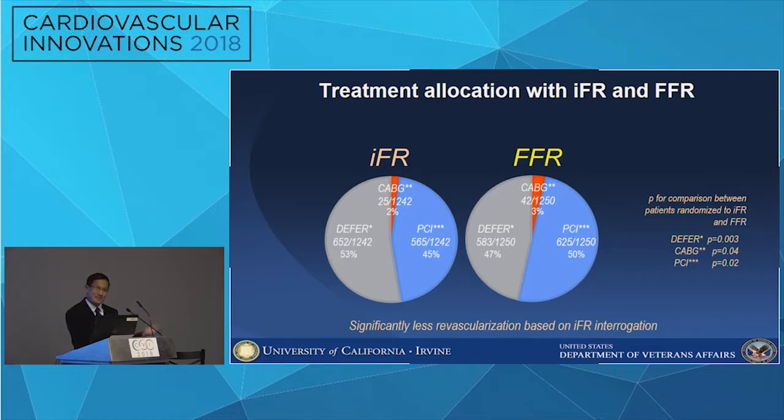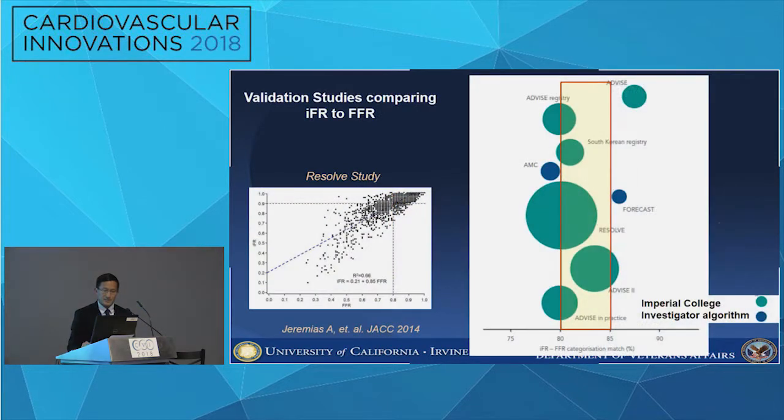But those of us in America who might want a stent, you might say, that maybe something I might not want to do. So this is something of interest, but because it gives you slightly different answers, 20% of the time, the revascularization may differ as well.